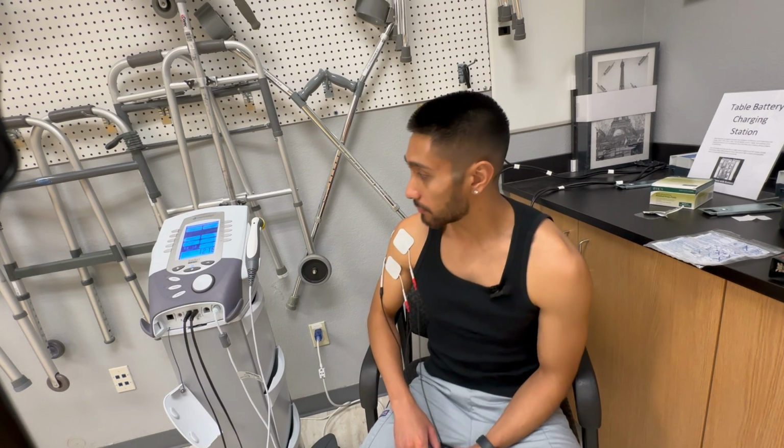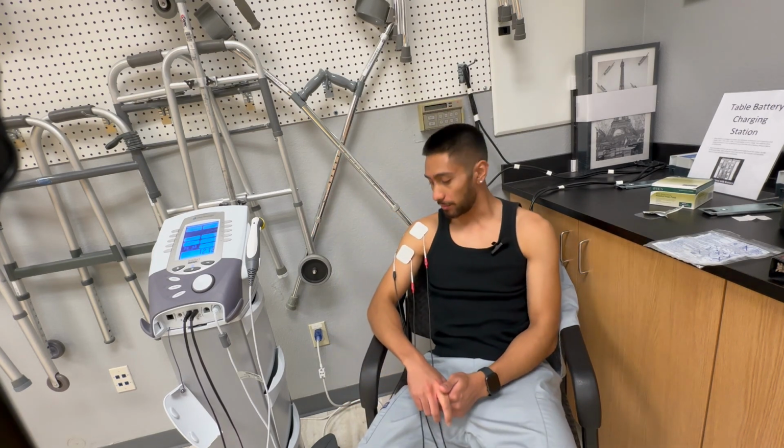Right now we have 12 minutes left of treatment time.